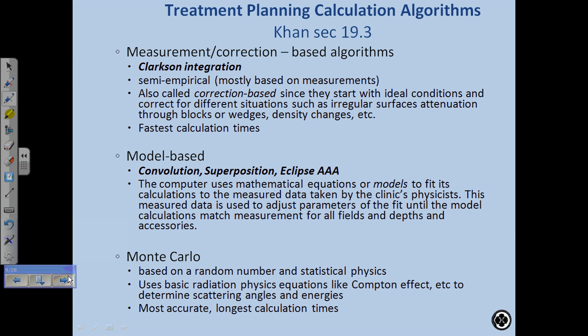Okay, let's talk about algorithms now. There's a lot of stuff on the slide, but this is a summary of all the algorithms that you'll probably see. We're going to start with the most basic one, and the most basic one is measurement or correction-based algorithms. The only one that I can think of is the Clarkson integration. We've talked about that a little bit.